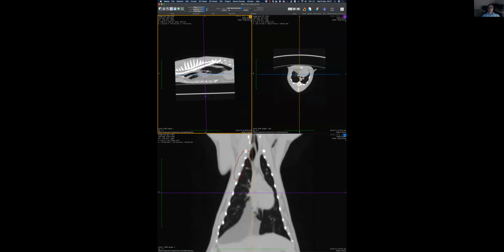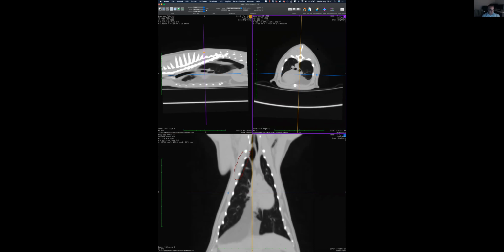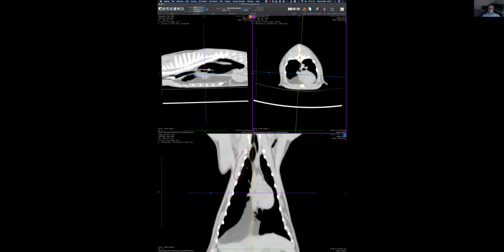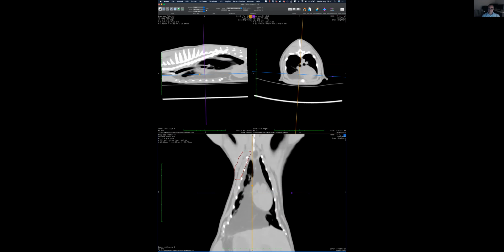And now I want to play with the ideas. The reason why I brought this case is as a continuation of the idea of the grapes. So now we go very simple, not so much in location. The exercise that I want you to play is the exercise about opacities. Do you remember the opacities? When I show you the grapes, there were two opacities. There was the opacity of the grape and air. And then the opacity of the fluid was the same opacity as the grape.